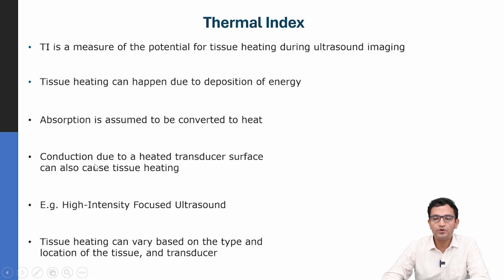Also, conduction due to heated transducer surfaces can cause tissue heating. For example, let us consider high intensity focused ultrasound, a therapy modality in which high intensity ultrasound is used to destroy tumors. In this therapy, the treatment duration can be fairly long, because of which the transducer heats up, and sometimes the patients who are getting treated can get surface burns because of direct conduction of heat from the transducer surface to tissue.